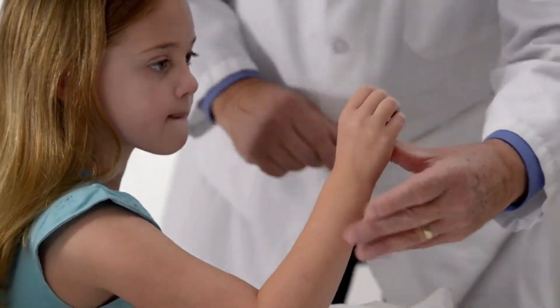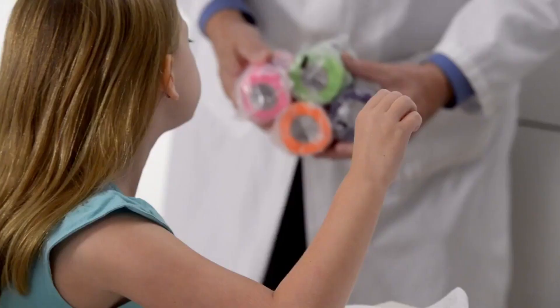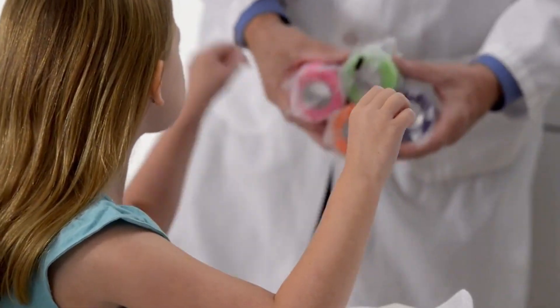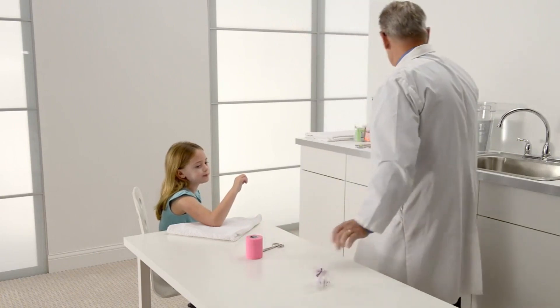The wrist and hand should be placed in an anatomically neutral position. Potentially constrictive materials such as stockinette should be avoided for this procedure. Cast padding may be applied to the extremity to meet treatment goals, or if it's a fresh fracture, to accommodate anticipated swelling.